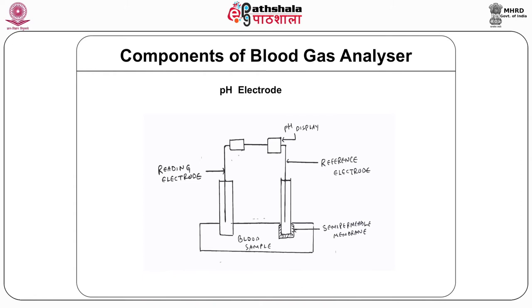The important point to be kept in mind is that both the electrodes must be kept at 37 degrees centigrade.